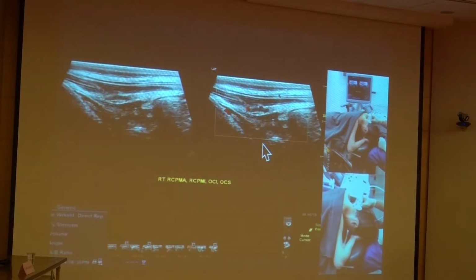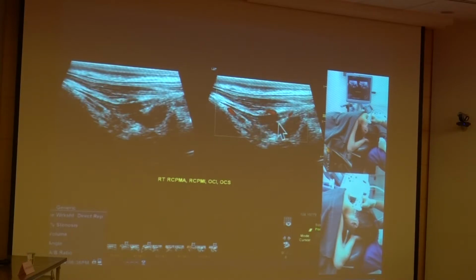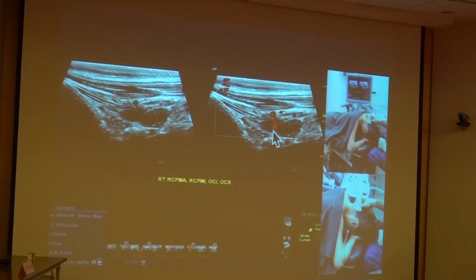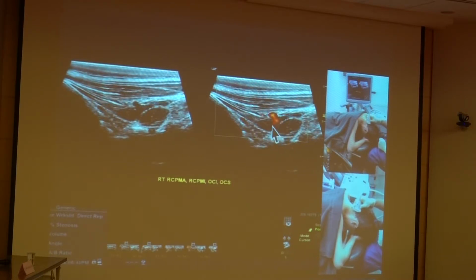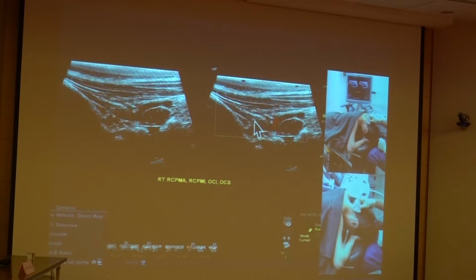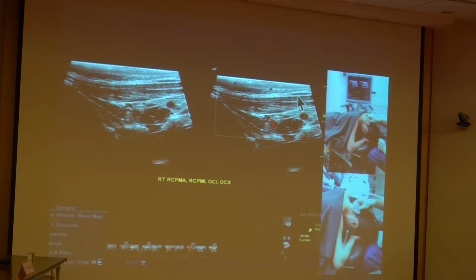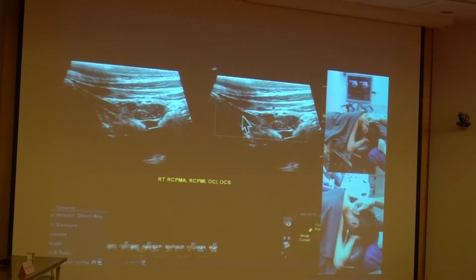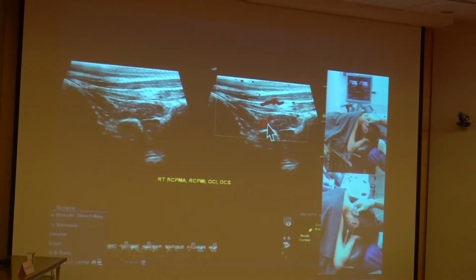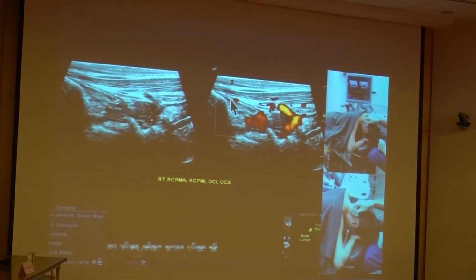This time I'm trying to do that from the midline again, and you're seeing the major, and you're not seeing the minor now. Then you're seeing the obliquus capitis inferior and the major, and very soon you're going to see semispinalis capitis, and then the obliquus capitis superior, and this is the dural bridge I was talking about.